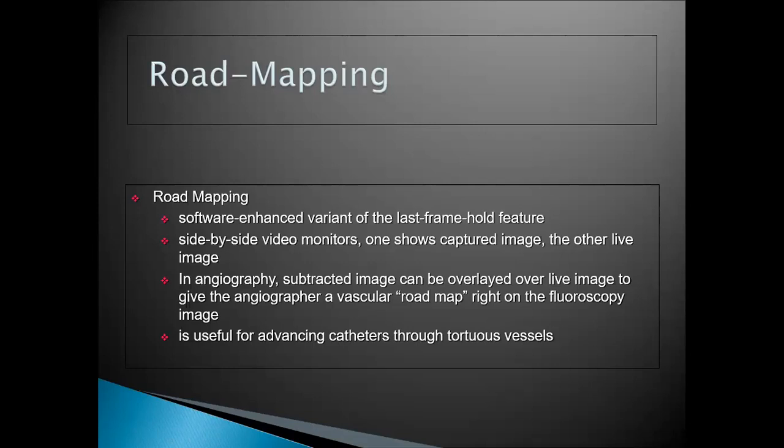while the other monitor displays the advancement of, maybe, the contrast we've given. We want to see how the contrast spreads throughout the body, and the other one shows the last frame. If at another point in time you activate the last frame hold again, it shows you the most current picture on the first computer, which shows the captured image. At every point in time, you just press the last frame hold on the first computer. It shows the last image captured, and so on and so forth.